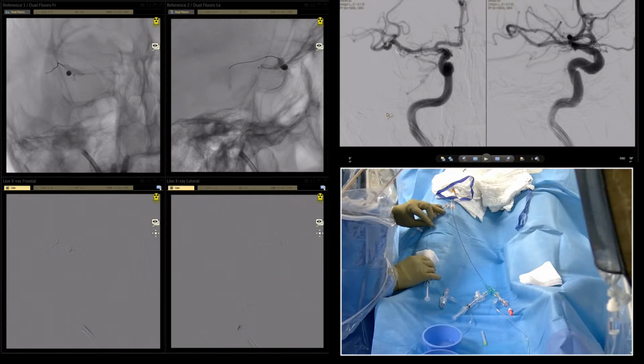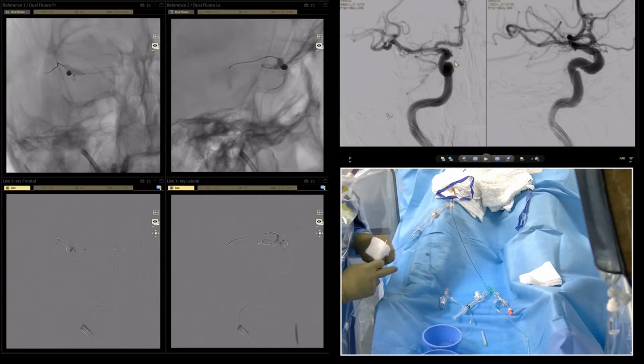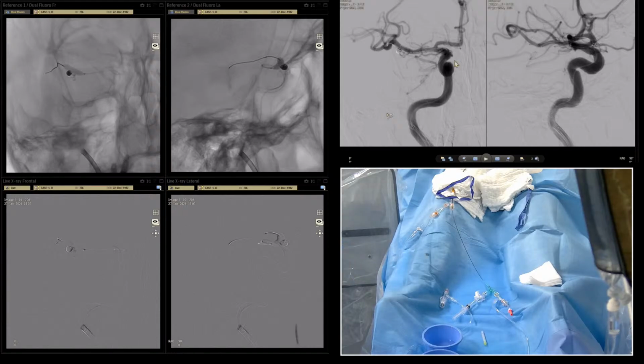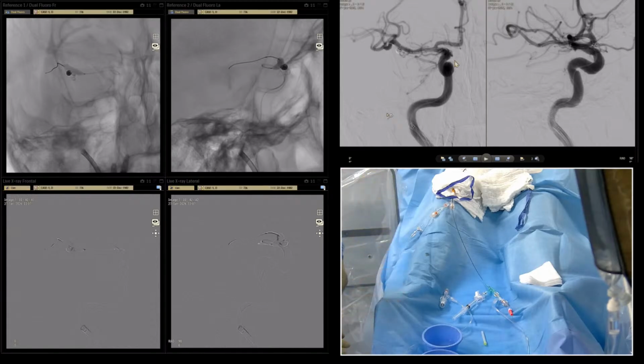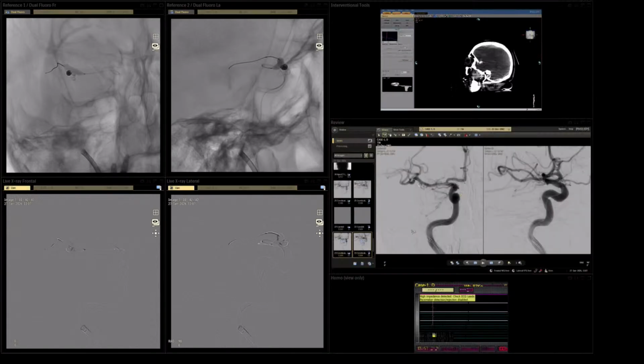It might be around the Headway. Yes, the option number 2, maybe we'll need a stenting. Okay. Let's wait for a couple of minutes. It looks like a small piece of the liquid embolic. It's around the balloon. Around. Awesome.